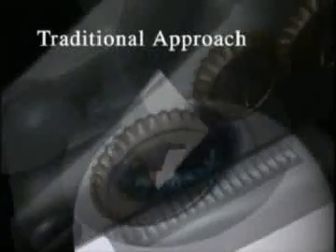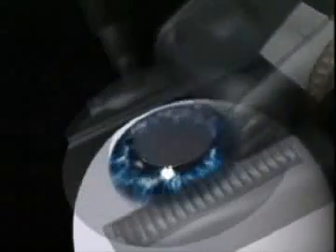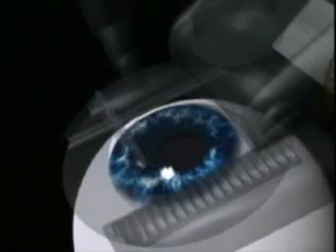Traditionally, the LASIK flap was created with a microkeratome. The microkeratome is a handheld device which has an ultra-precise blade. The blade is used to sculpt the cornea and create the flap.